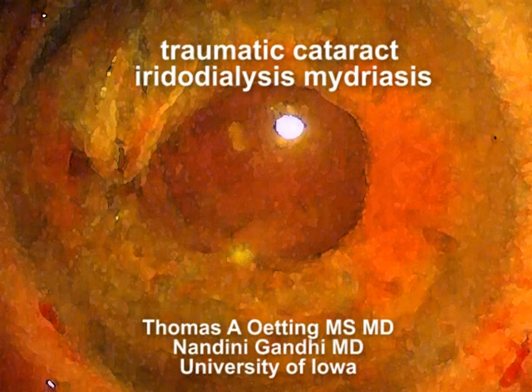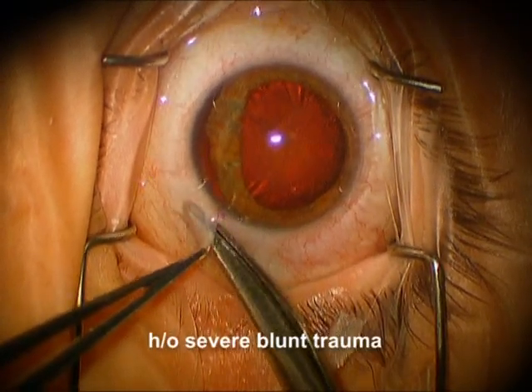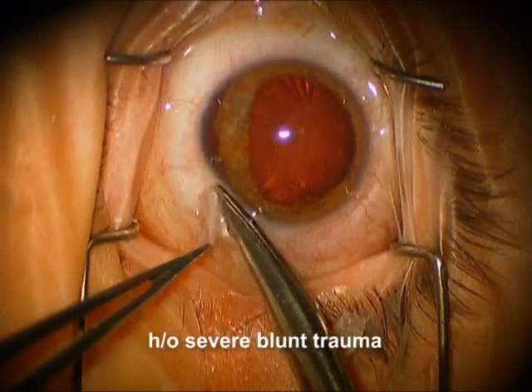Hi, this is Tom Oetting at the University of Iowa. I'm going to show you an interesting case that we did recently. It's actually two cases in one on the same patient. Here you can see we've got a patient that had severe blunt trauma.